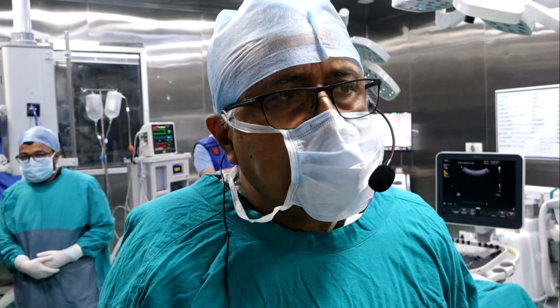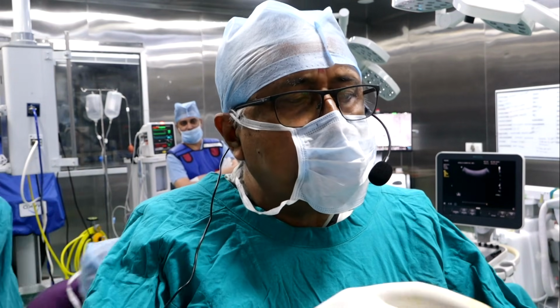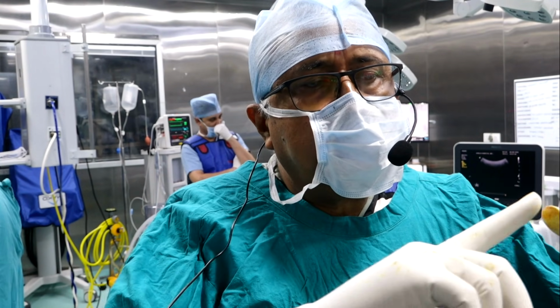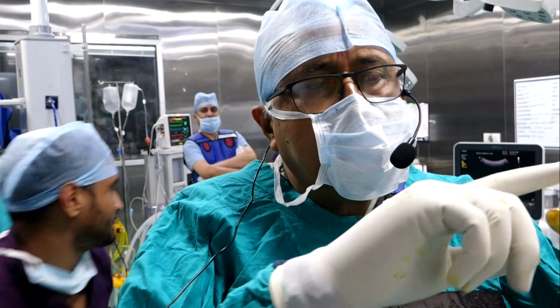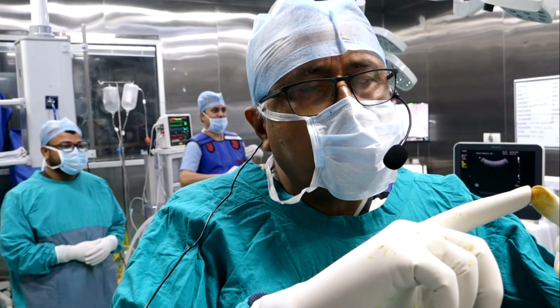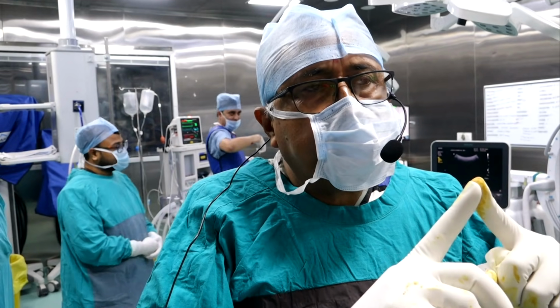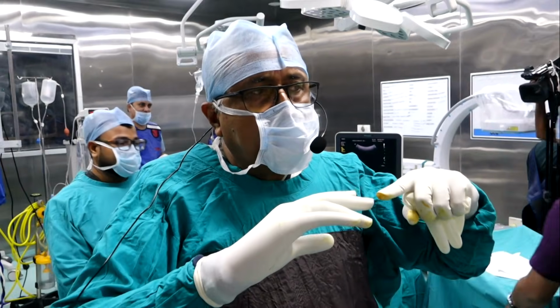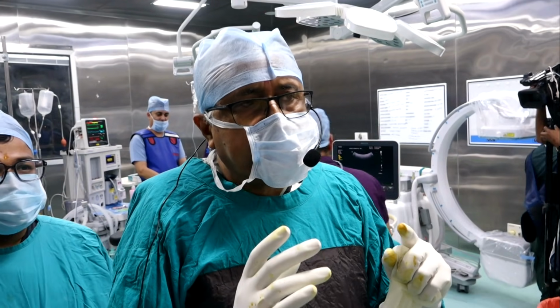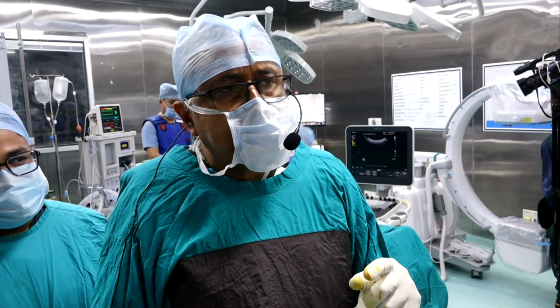So those dynamic braces at 50 degrees angle, what I mean to say is, जो dynamic brace रहता है उसमें upper leaf and lower leaf के बीच में जो आपकी watch रहती है उसमें आप 50 degrees angle set कर देते हो. So now patient can flex the knee to 50 degrees also, but while wearing it there will be no side to side movement, so the ACL is protected. This is very important, as important as the procedure.